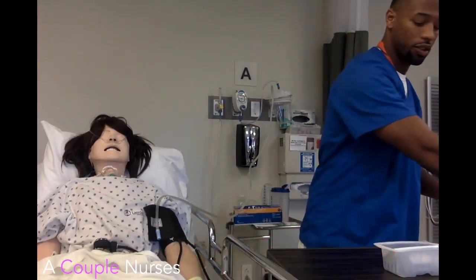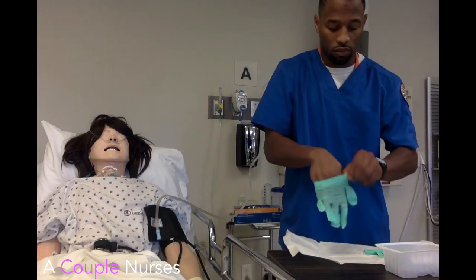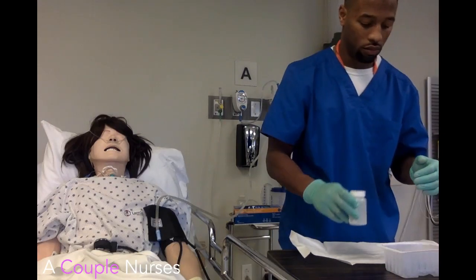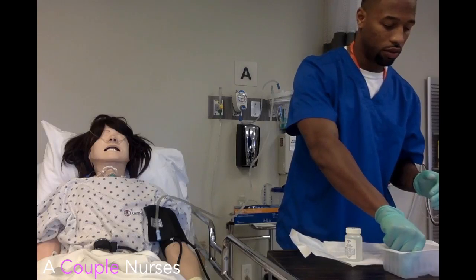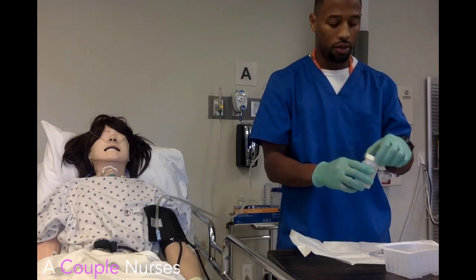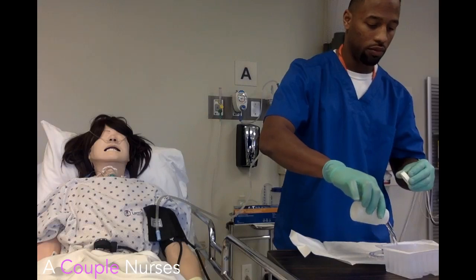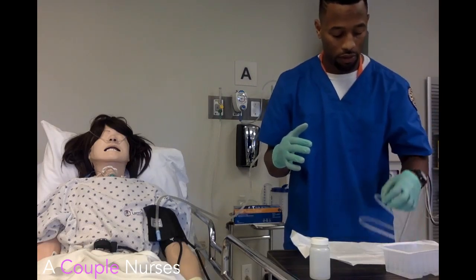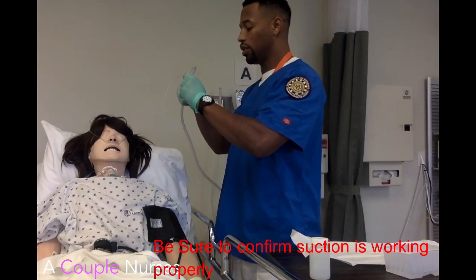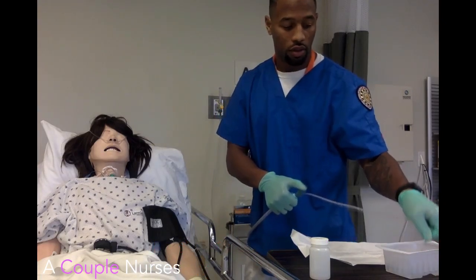Regular suctioning per doctor's order, which is about 70. Let me get my suction kit opened up. This is a sterile procedure. I'm going to use my sterile hand, which is going to be my left hand, and my right hand is dirty. Make sure the suction is working — suction shows to be working.